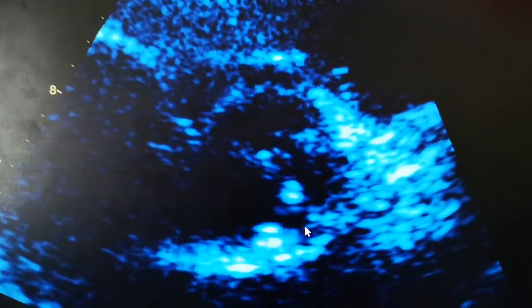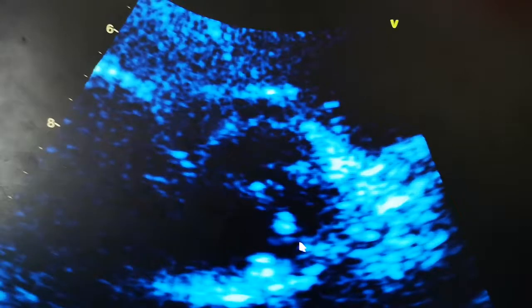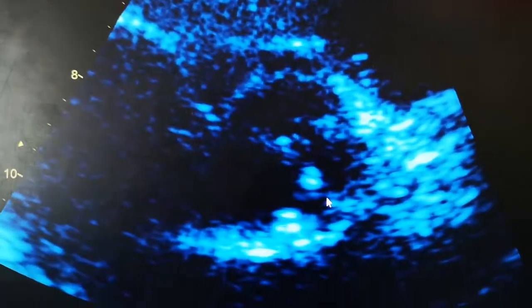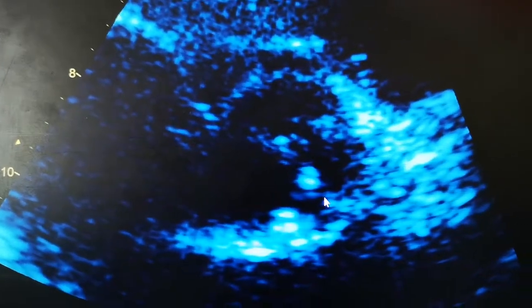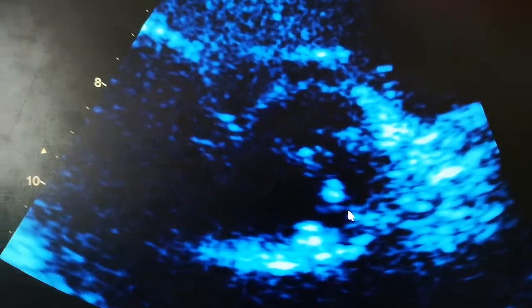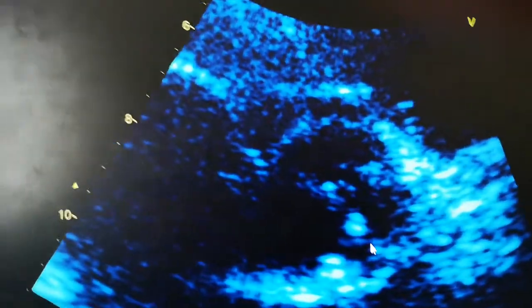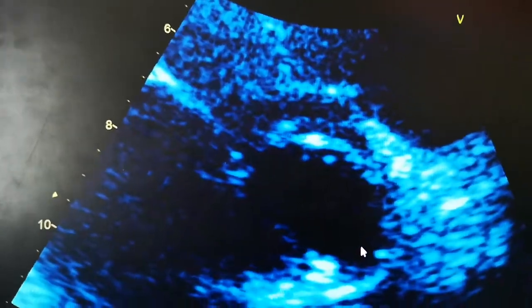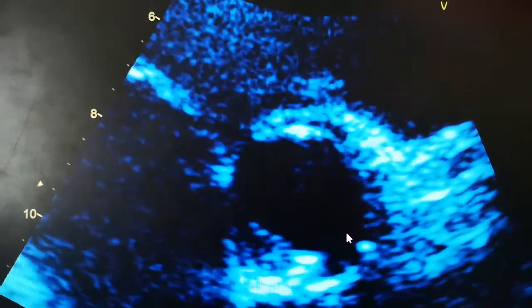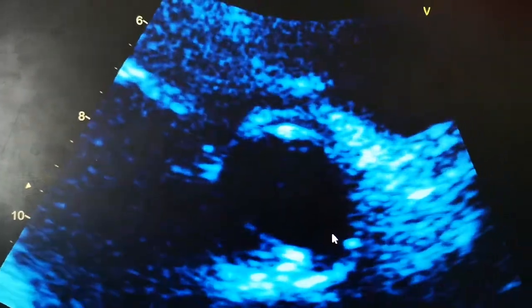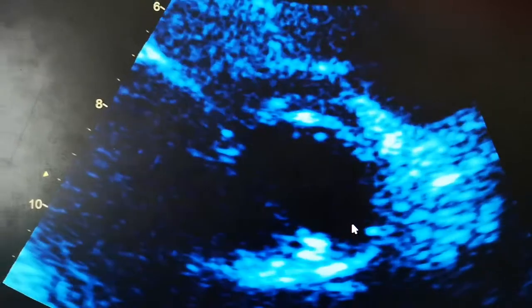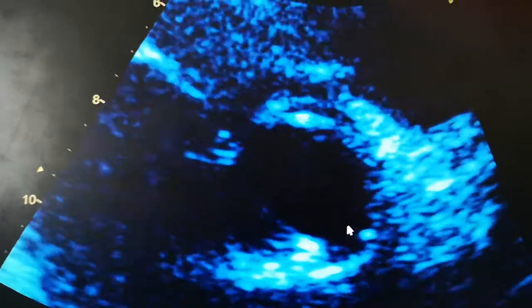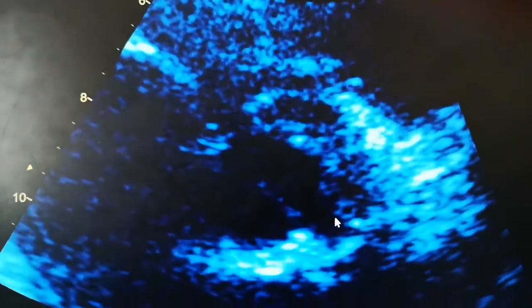So never count the number of cusps of an aortic valve during diastolic closure. Always do that during systolic opening and try to slow it down frame by frame.